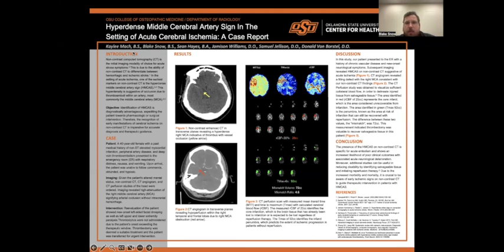The CT perfusion study was obtained to visualize sufficient collateral blood flow in order to delineate injured tissue from salvageable tissue. The area identified in red represents the core infarct, which is the area considered unrecoverable from infarction. The area identified in green is the penumbra, known as the area at risk of infarction that can still be recovered with reperfusion. The difference between these two values, the mismatch, was 72 cc. This measurement indicated thrombectomy was valuable to recover salvageable tissue in this patient.